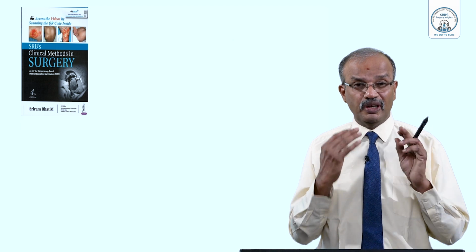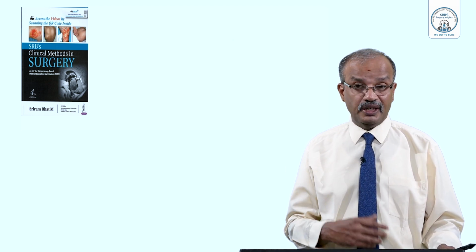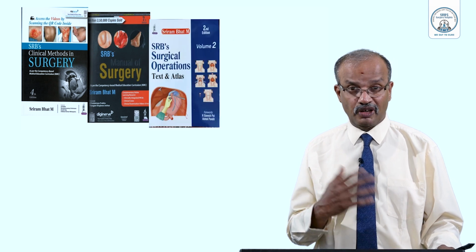So students, remember, one of the first very commonly kept X-rays in OSCE or in the X-ray section during your practical exam is gas under diaphragm, very commonly kept. So I have detailed everything about that. Read my clinical book, it contains X-rays. Read SRB manual of surgery for detailed gastric ulcer, duodenal ulcer perforations and different conditions.